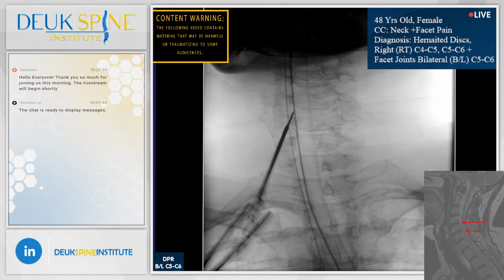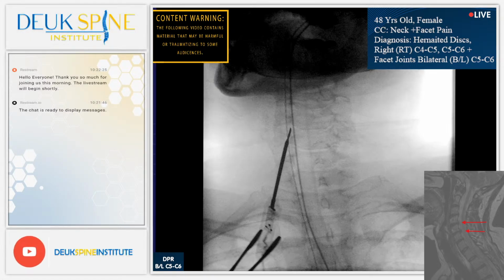Jordan, can you zoom in a little more so I could see a little bit better? All right. I think it would be the other. Is this the panel, the detector here? Yes. All right, so the emitter is down lower? Yes, sir. Very good. All right.